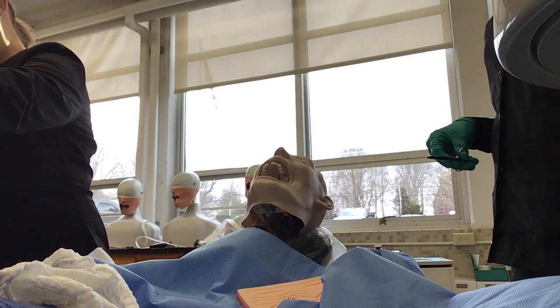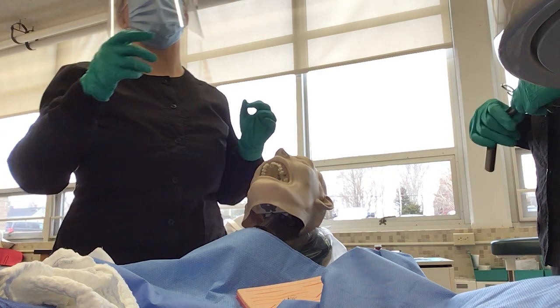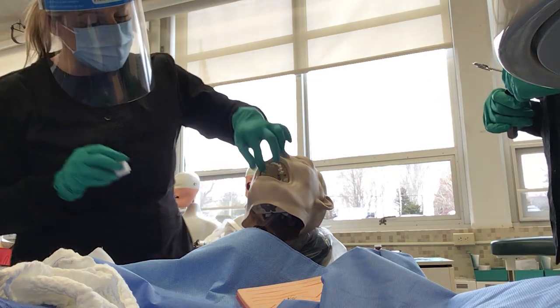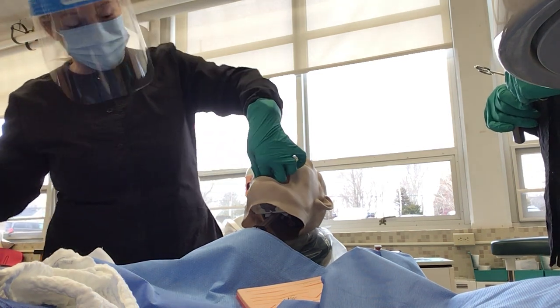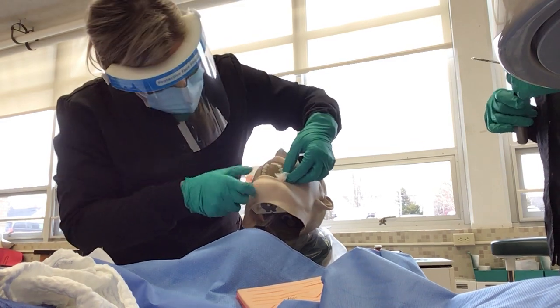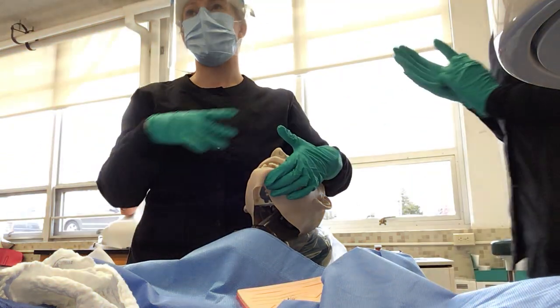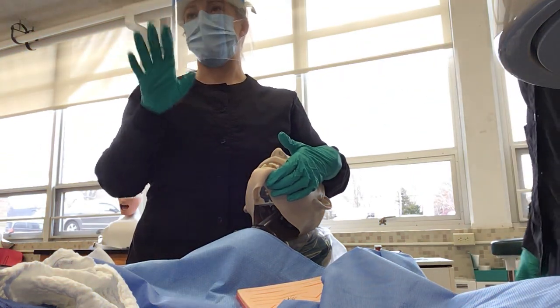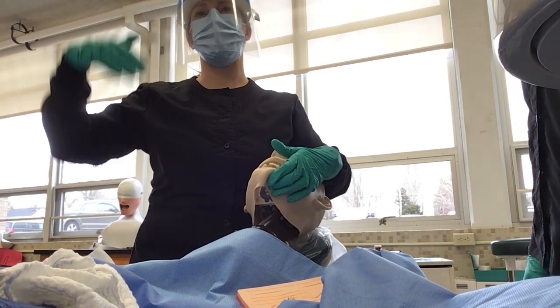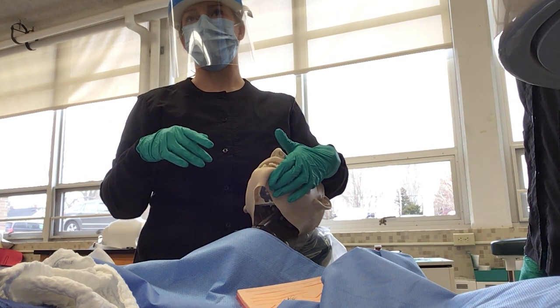Okay, so our sutures are in, so now she's going to pass me two 2x2s folded in half and then half again. Thank you. I'm going to take the throat pack out, take that gauze out, and we're going to have him bite down, okay? At this point, he's going to be a little woozy. We're going to wake him up, and two of us are going to move him to the recovery room. At that point, he should not be left alone, so one of us would stay, one of us would go get his ride or chaperone and bring them to sit with him in the recovery area, okay?